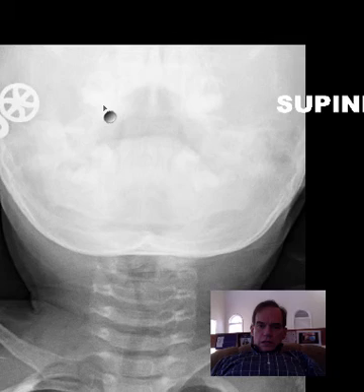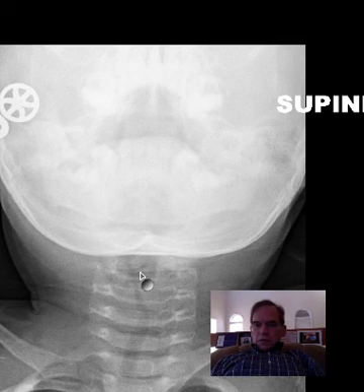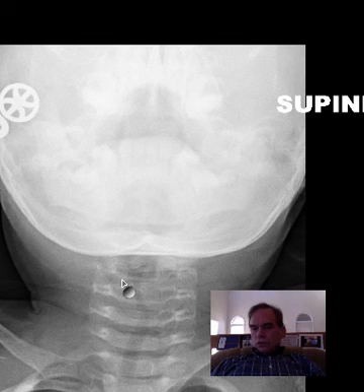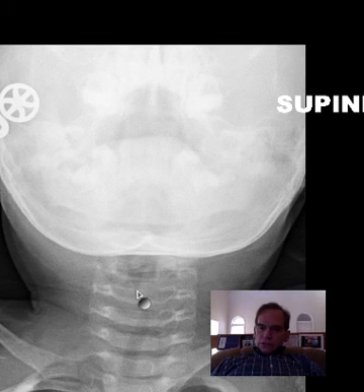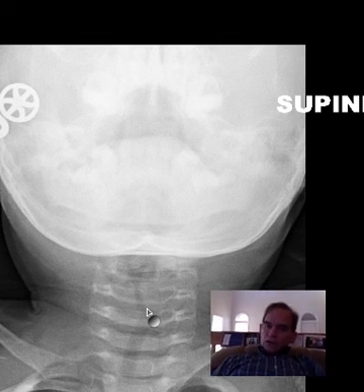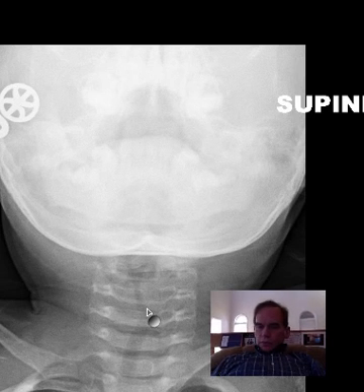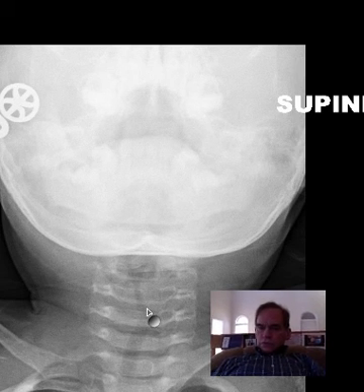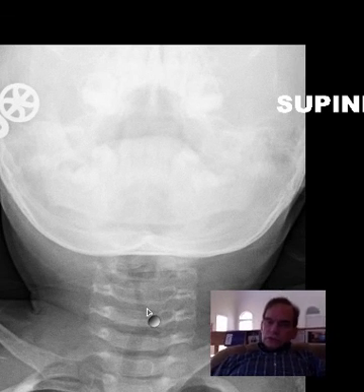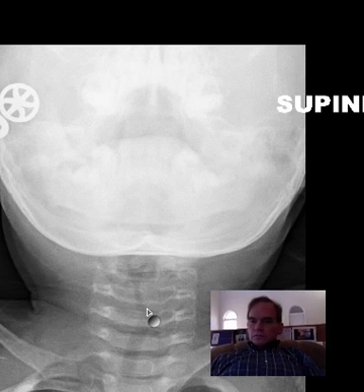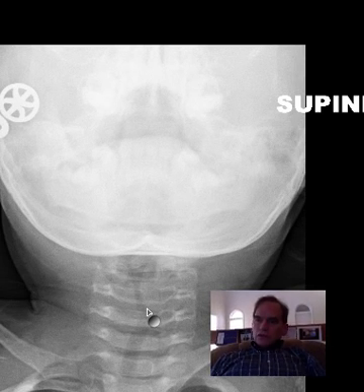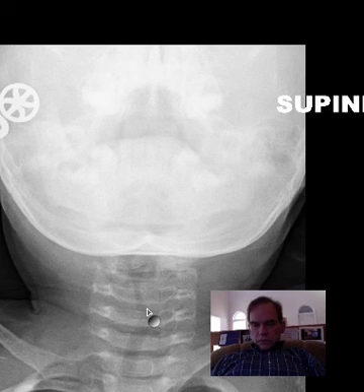On the AP view again, this would be the level of the glottis or the vocal cords, and this subglottic area of narrowing is croup. It can produce severe problems with breathing sometimes, and is most often of a viral etiology, although it may be bacterial.